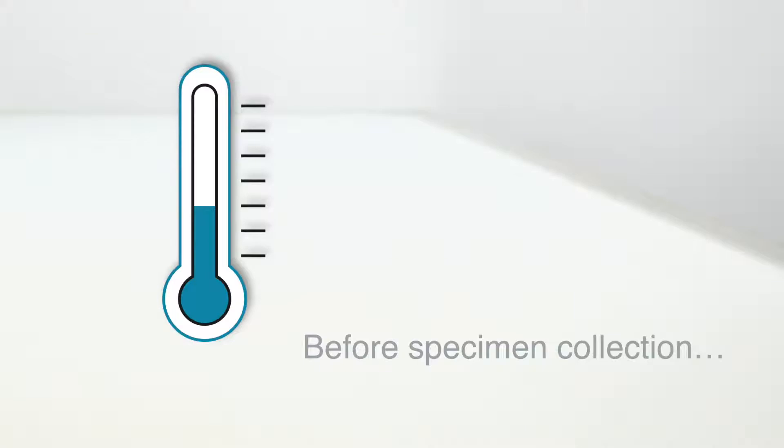To obtain the best results when sampling, carry out the swabbing and later the test itself as well, at a room temperature of at least 15 degrees Celsius. This ensures that the rapid test works properly and reliably.